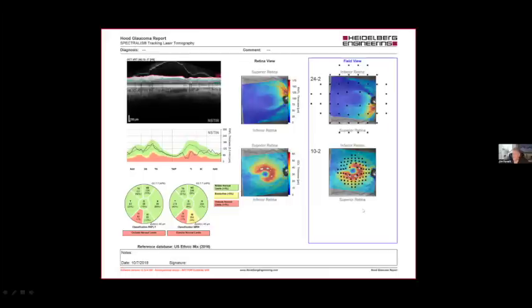So again, it's a relationship between the anatomy that we are given at birth and then the visual field testing points that are overlying that. So we can move on to neuro-op, if you will, but I want to kind of open that.